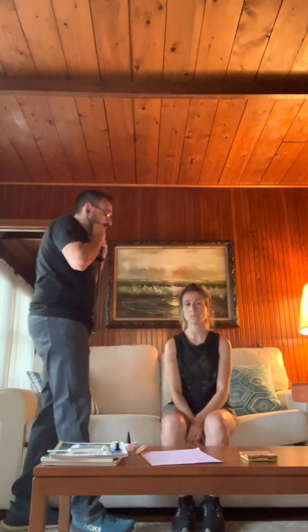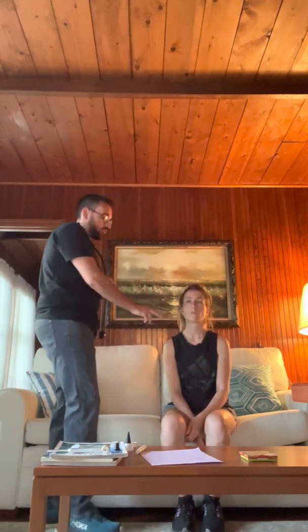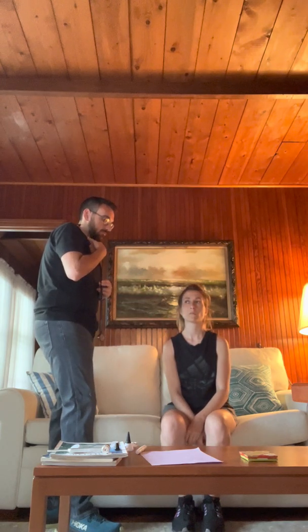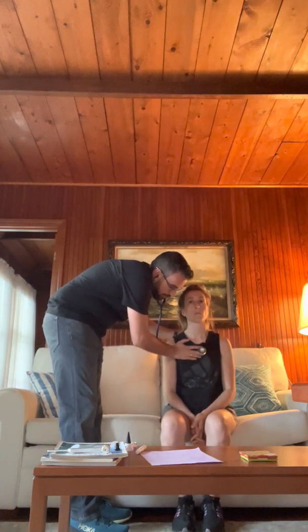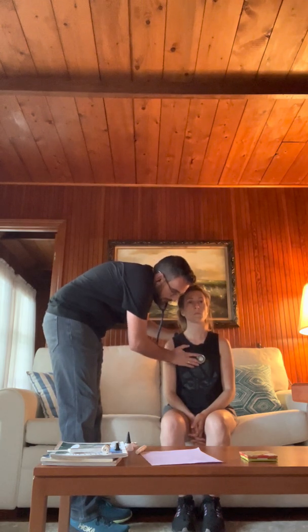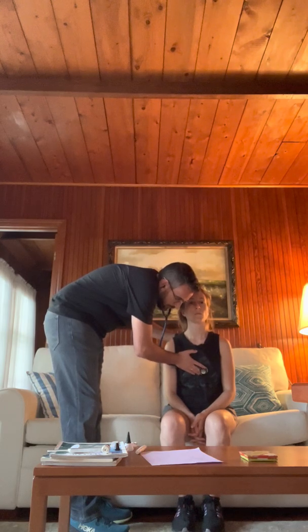Perfect. So let's go back to the thorax. I'm going to listen to your pulmonic, tricuspid, mitral, and Erb's point first. Down to the Erb's point, which is at the third intercostal, mitral. Perfect.